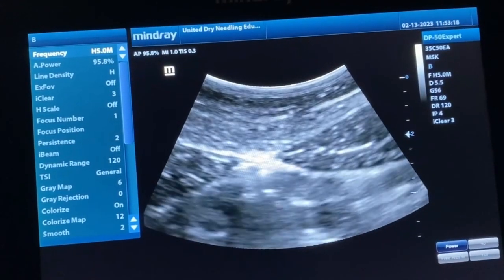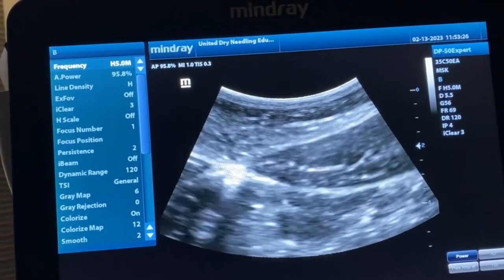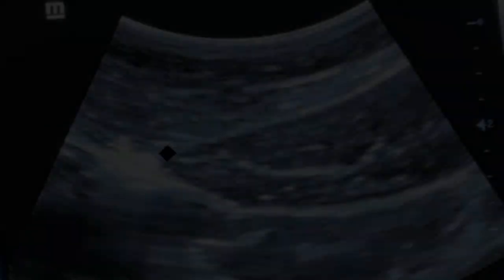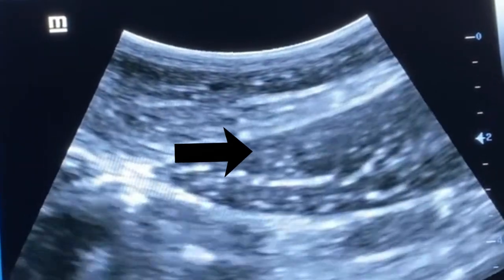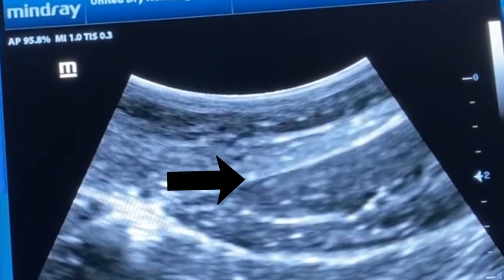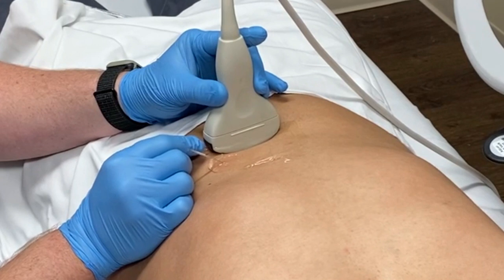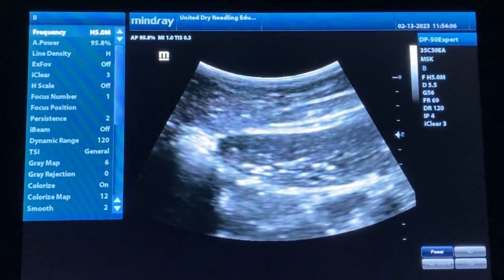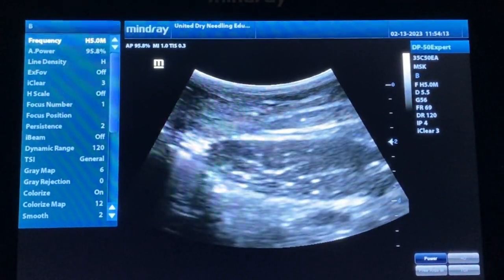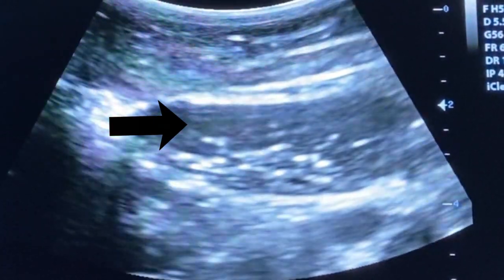Now we can see the rectus abdominis head with the linea alba in the middle. I've identified the rectus abdominis head, I tap my needle in, and now you can see that movement — the movement is the needle piercing into the muscle. You actually just saw that muscle jump — that was a really cool local twitch response that happened when the needle got inside the muscle. Here's a close-up with an arrow pointing to how the needle is going inside the muscle. You can clearly see that I'm not piercing the bottom of the muscle, and therefore I stay out of the peritoneum.